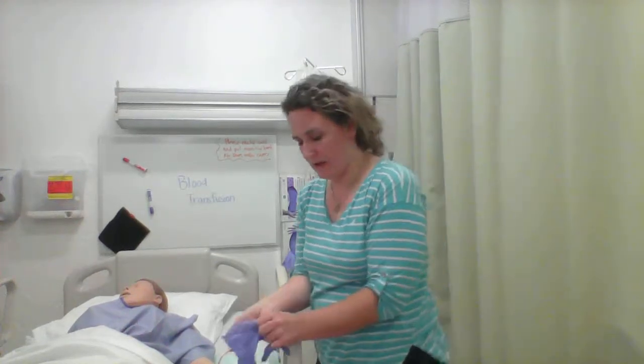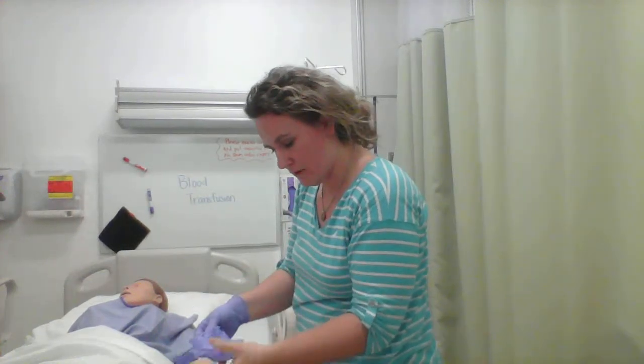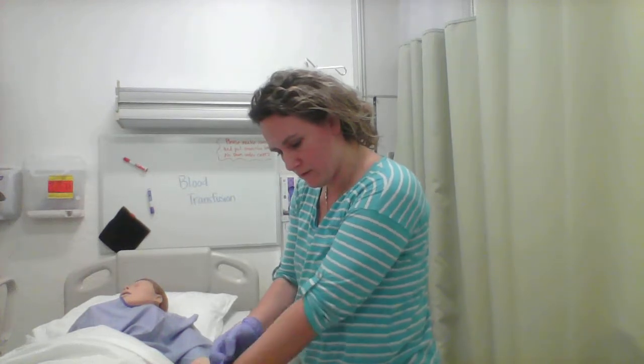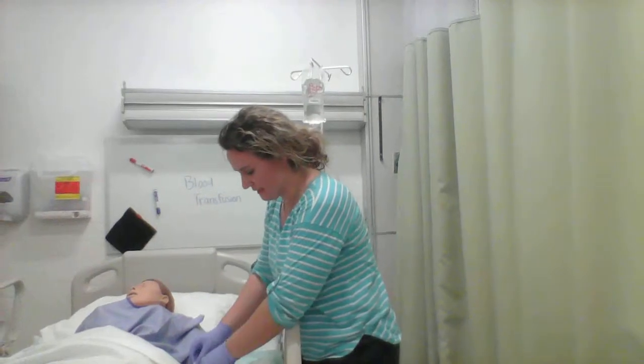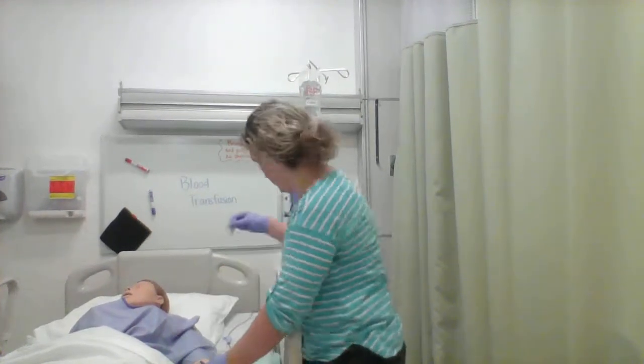I'm going to apply gloves just to be precautionary. Okay, so we're going to scrub the hub for 20 seconds and let that dry, and we did that.